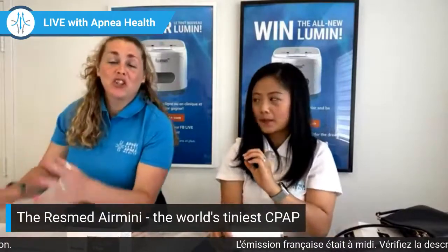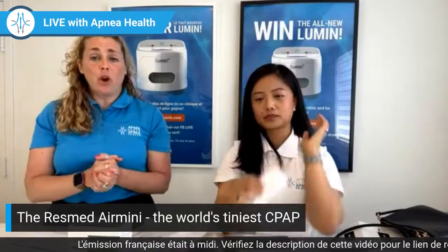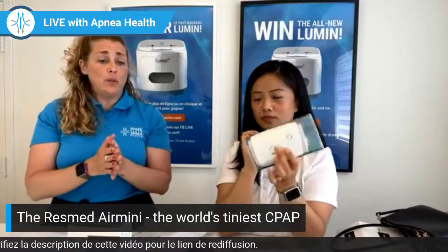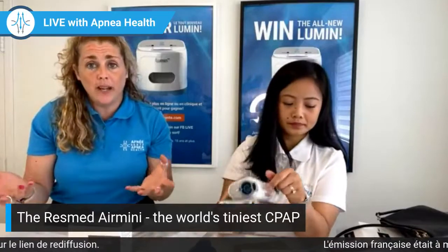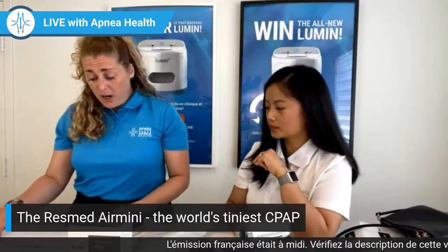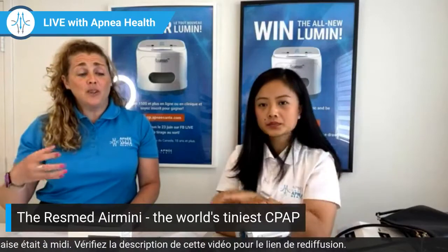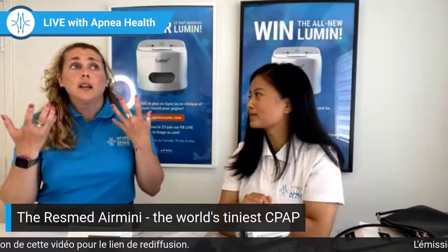For those who are just joining us now, today we're talking about the Airmini as promised from our last live. We're going through the entire pros and cons that we just did. We went through the compatibility of each mask. You're limited in a way, there are only 5 compatible masks. And now the question I have for you is would you recommend it for a first-time user or somebody who would use this CPAP every night?